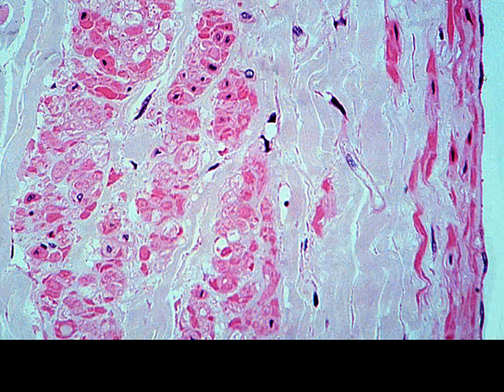Higher magnification, again, intima on the right, little bit of tunica media with our smooth muscle, and then we get into our adventitia. Again, this is not a real common occurrence, seeing these large smooth muscle bundles here. Again, cut in longitudinal section. These are circularly arranged, and these are longitudinal bundles. You won't often see that.